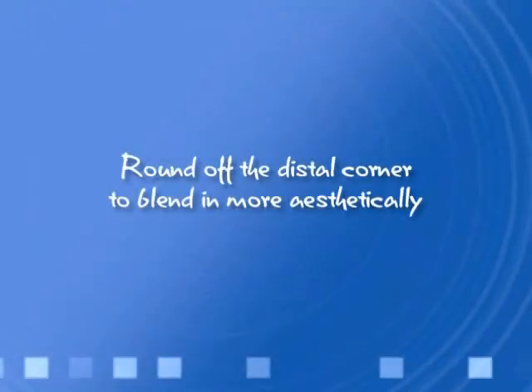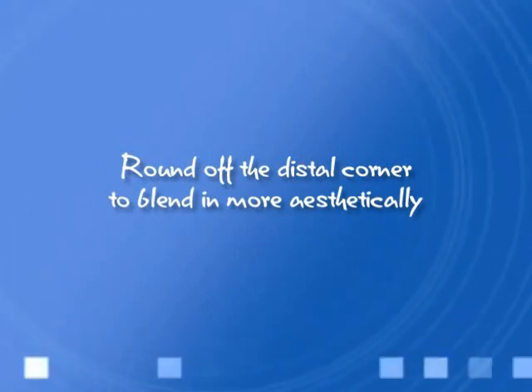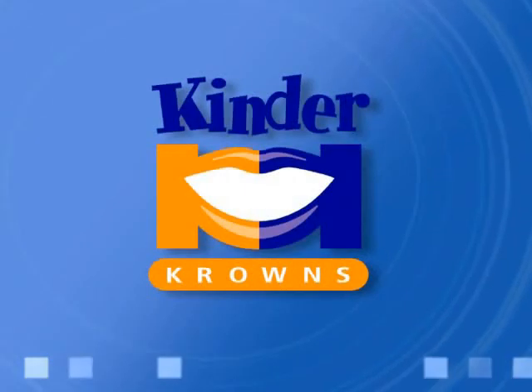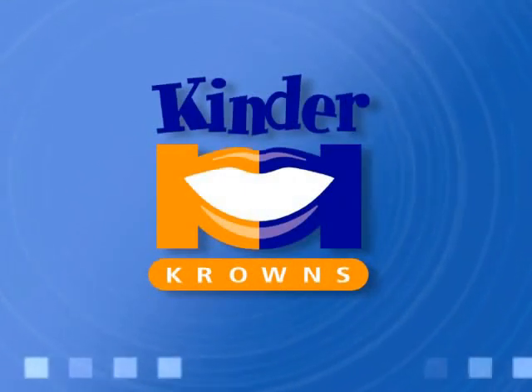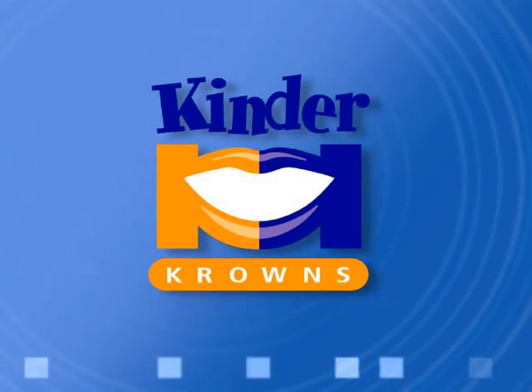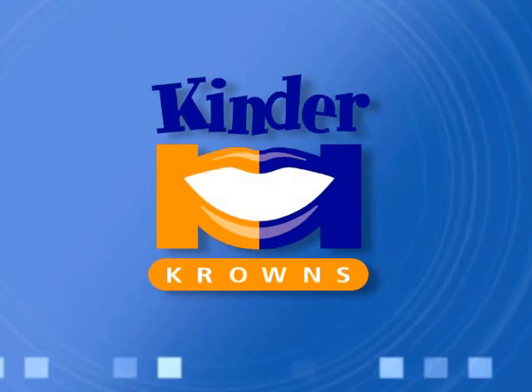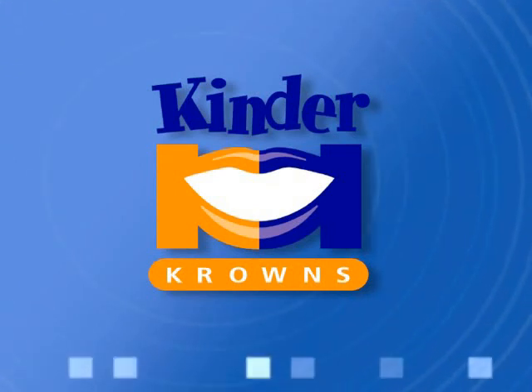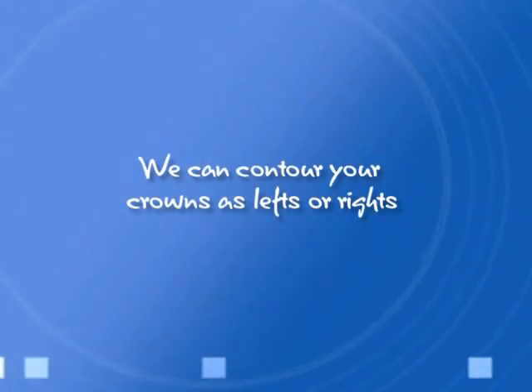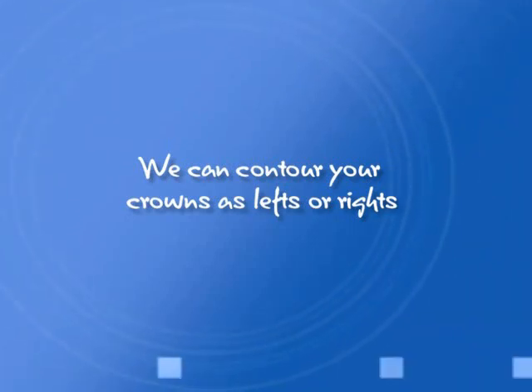Once the crown is cemented in place, you may round off the distal corner to blend in more aesthetically. This step is an optional step, and you will find that some cases will require it while others will not. After rounding the distal corner, polish the composite with your normal composite finishing procedure. Please note that we can contour your crowns as lefts or rights if you desire. Just let us know when you place your order.